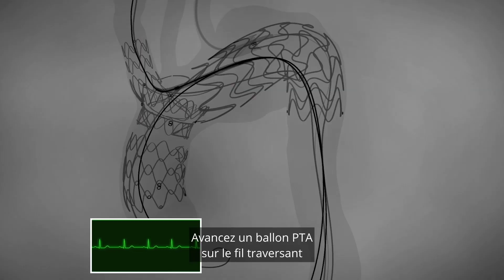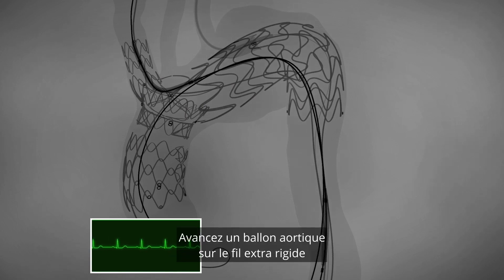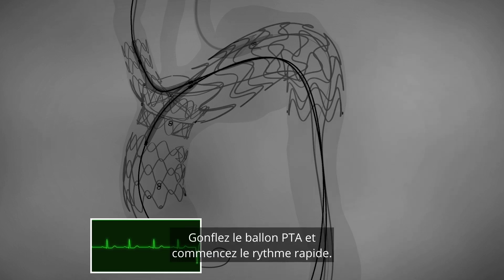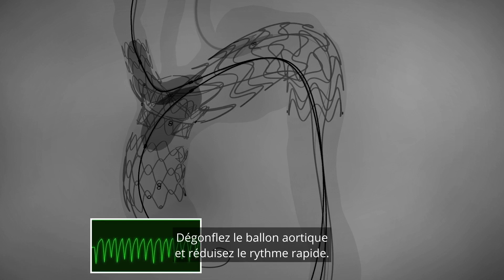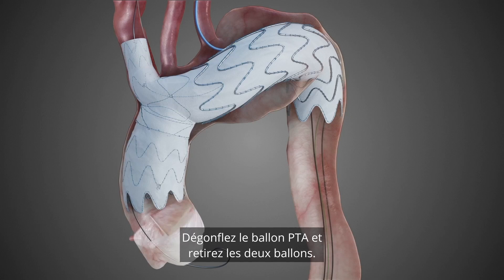Advance the PTA balloon over the through and through wire until half length is inside the branch. Advance an aortic balloon over the extra stiff wire until half length passes the dock ring. Inflate the PTA balloon and start rapid pacing. Inflate the aortic balloon. Deflate the aortic balloon and phase down rapid pacing. Deflate the PTA balloon and remove both balloons.